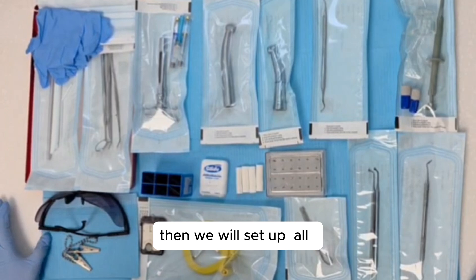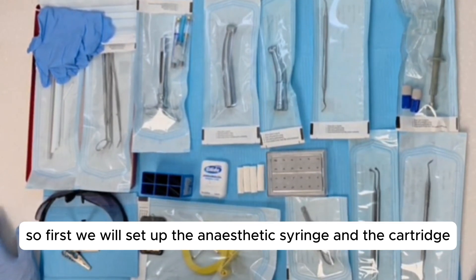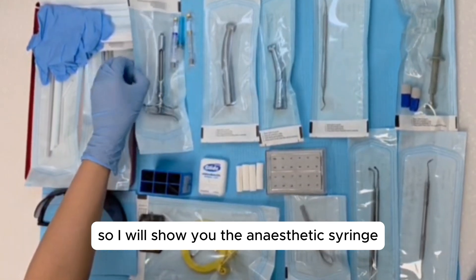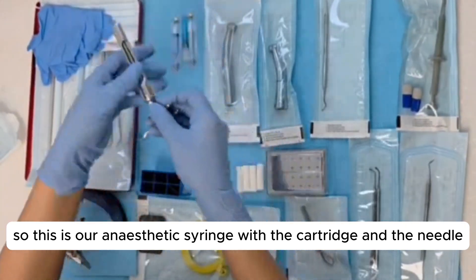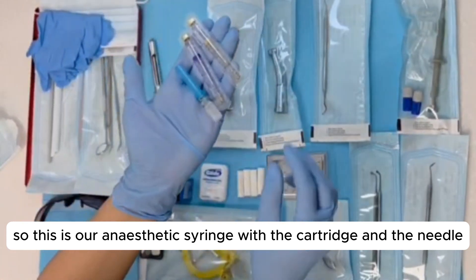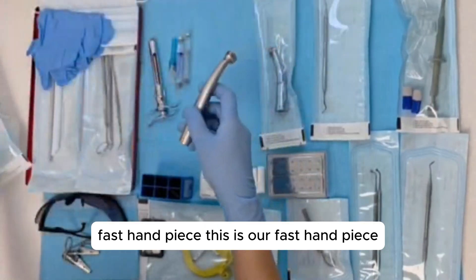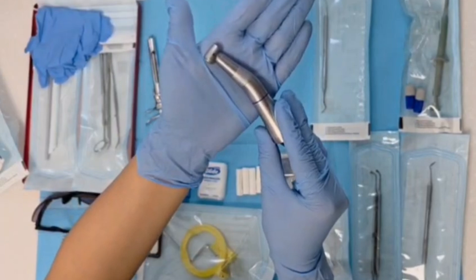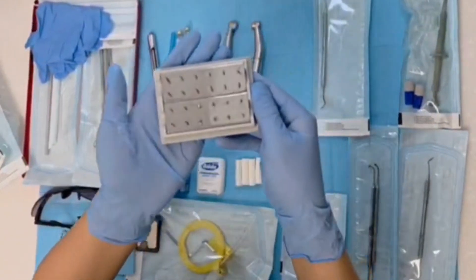Then we will set up all the required instruments for amalgam restoration stepwise. First we will set up the anesthetic syringe and the cartridge. This is our anesthetic syringe with the cartridge and the needle. Then we will set up the fast handpiece and the slow handpiece, along with their corresponding burs.